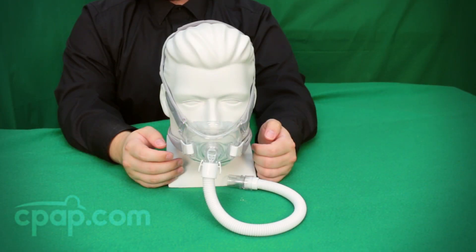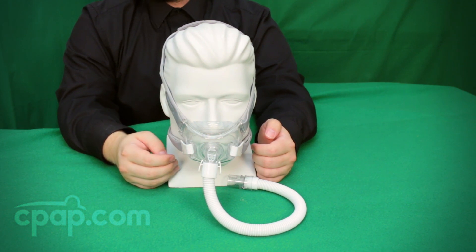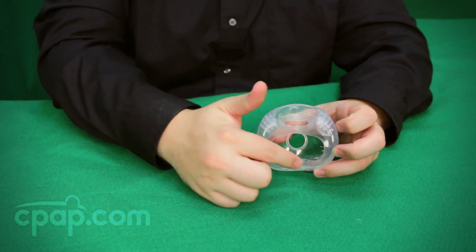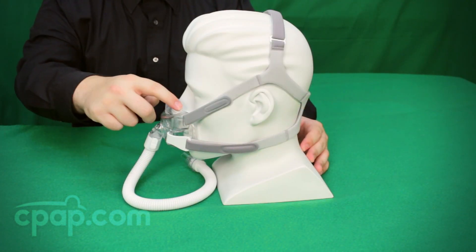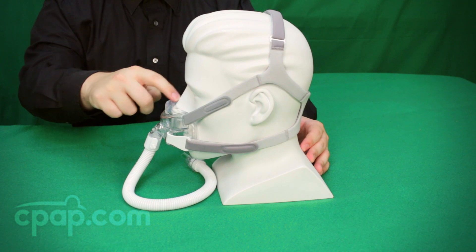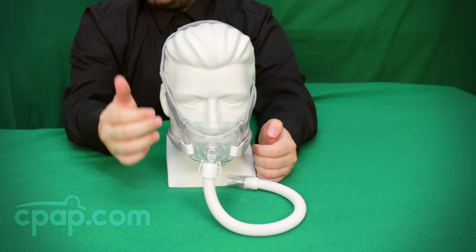Chris here with CPAP.com to introduce the Amara View Full Face CPAP Mask from Philips Respironics. The Amara View covers the mouth and has an innovative nasal seal that rests under the nose. The design of the seal leaves the bridge of the nose uncovered, which leaves line of sight open for bedtime reading or TV watching.